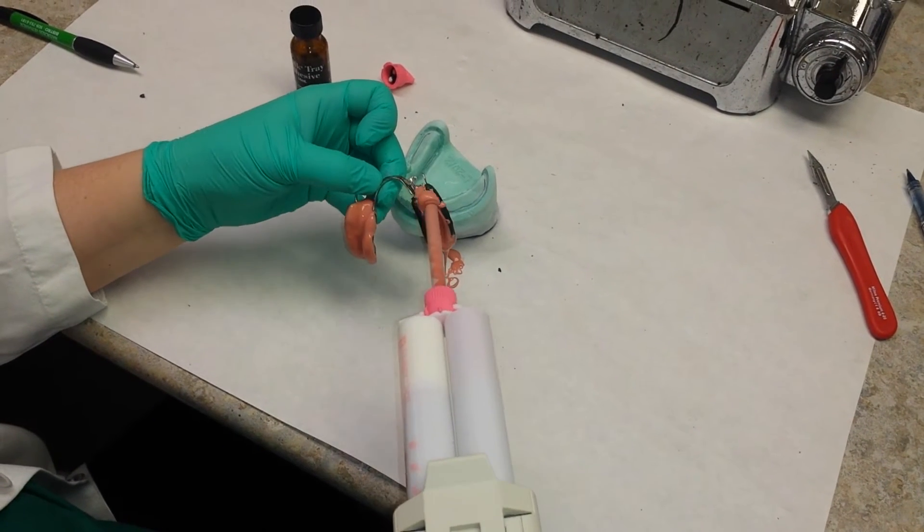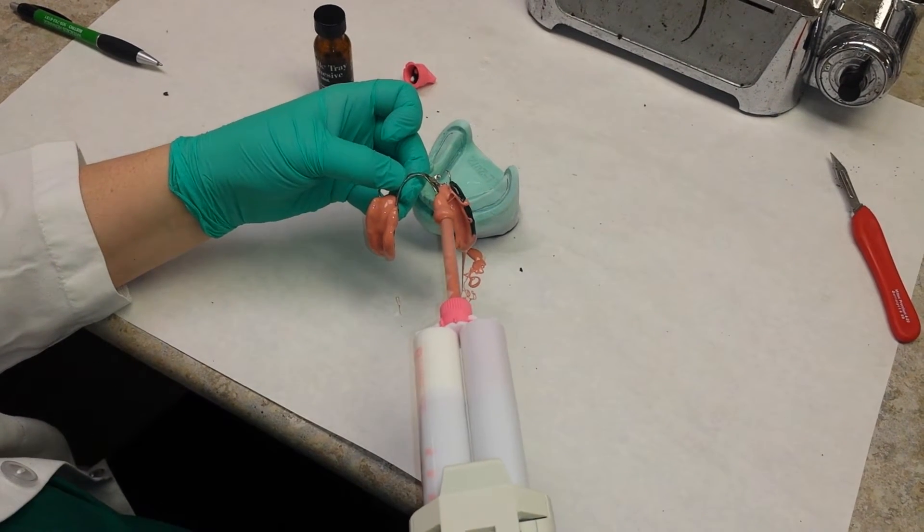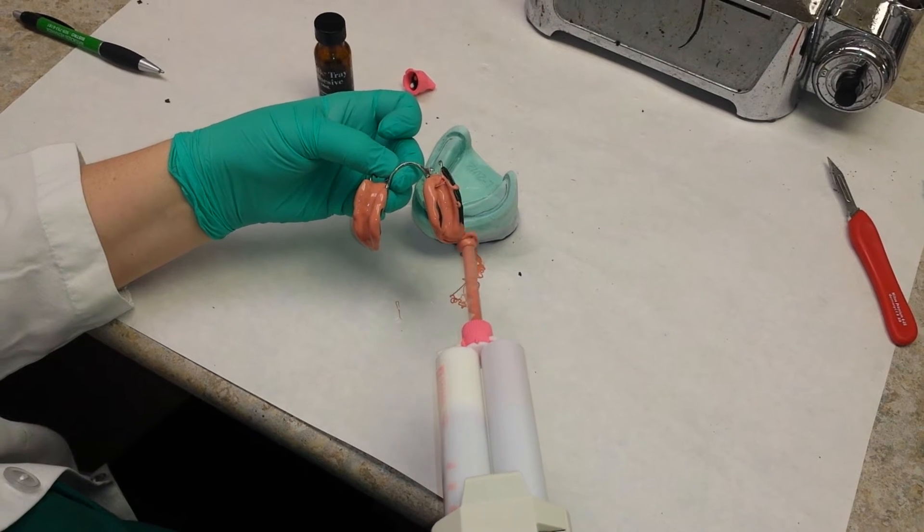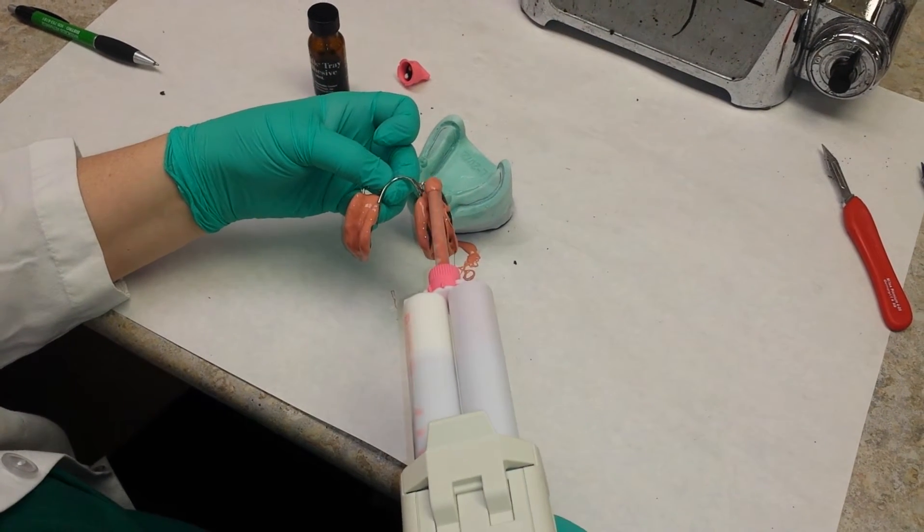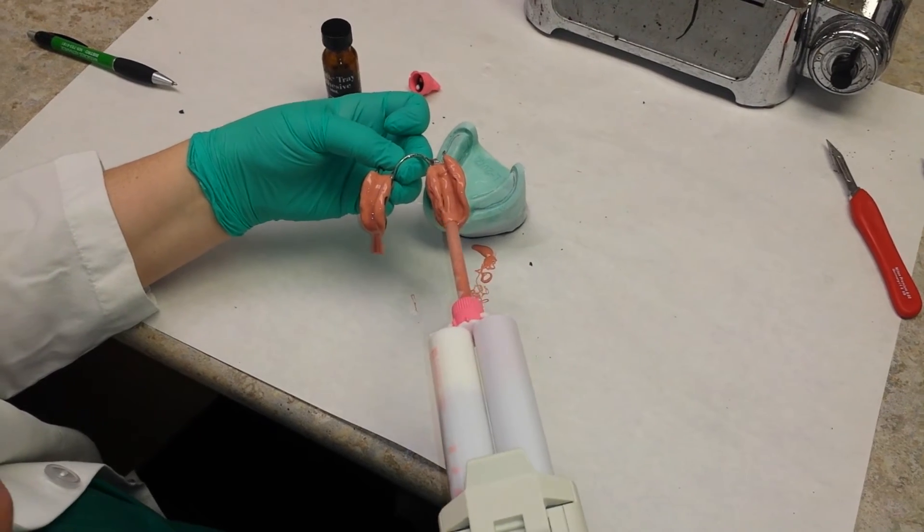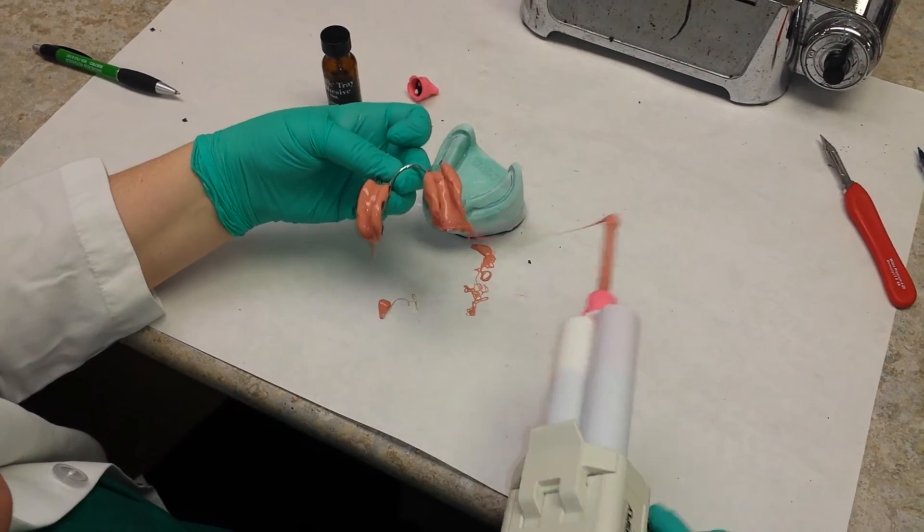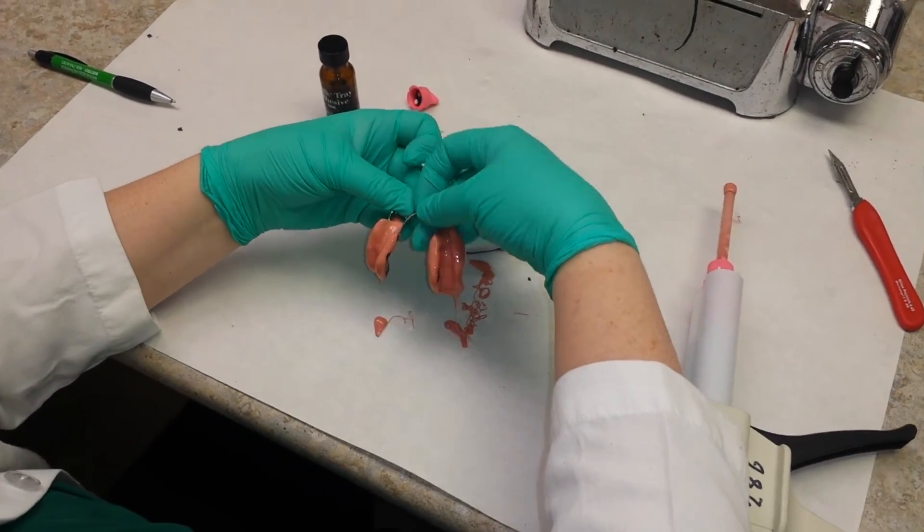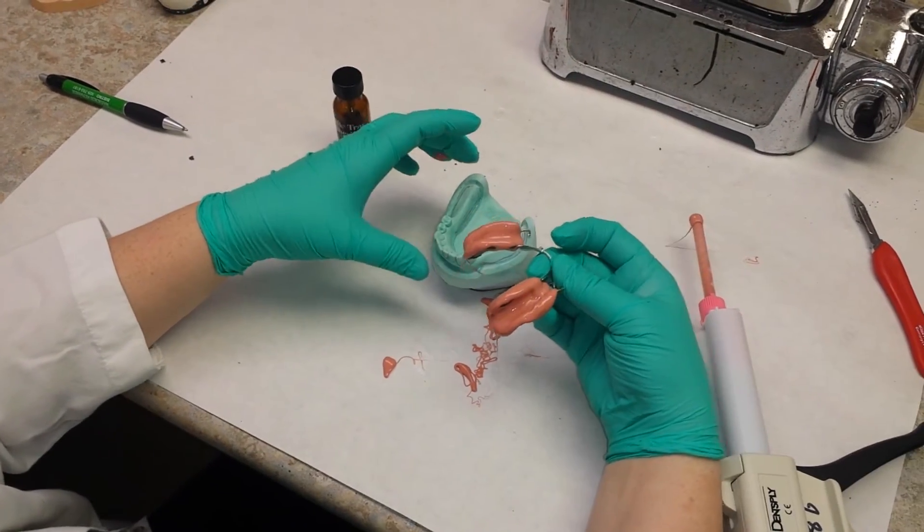I'm going to take some of the excess out of here. You want to have the same amount of material on the border as on the inside of the ridge because you're taking an impression of soft tissue. It's going to always be a little drippy with this light body material.